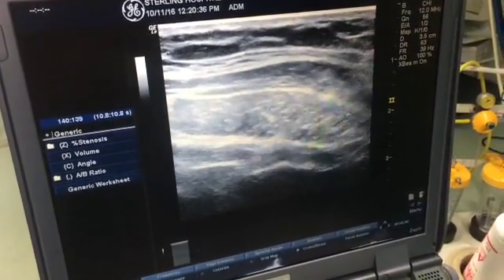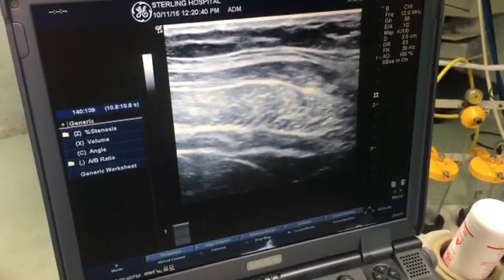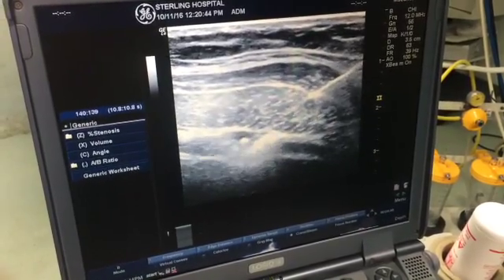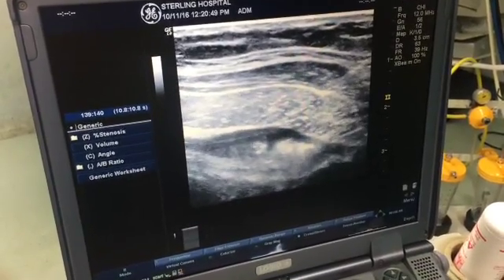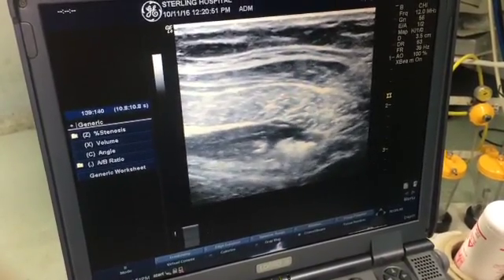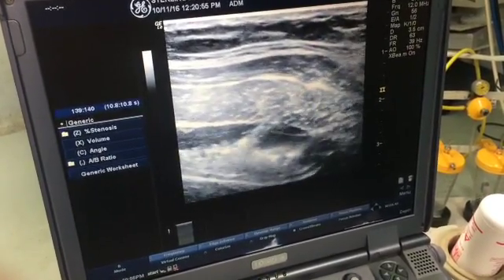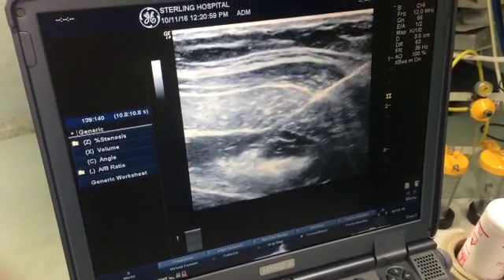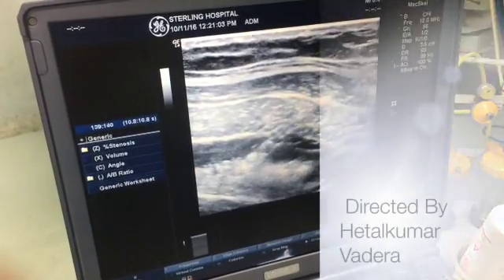Here I have reached almost the TAP plane. I have visualized the needle tip and I will inject some drug. As I inject, the plane will get separated. There is initially some air, and now I am injecting the drug — there is nice spread of the drug in the TAP plane. This block will act perfectly and give 12 to 18 hours of analgesia to the patient. This is a nice block for LSCS patients. Thank you very much.